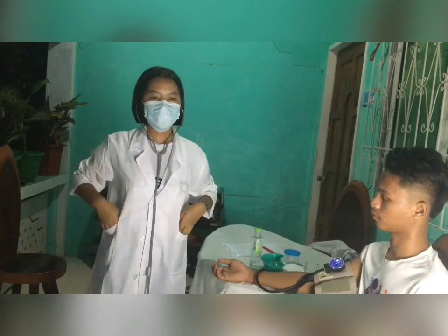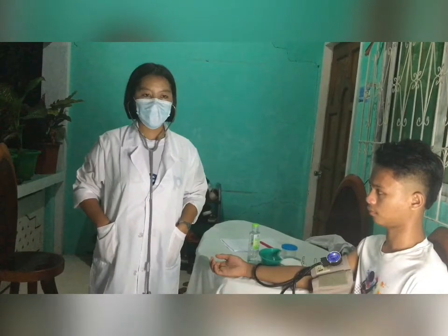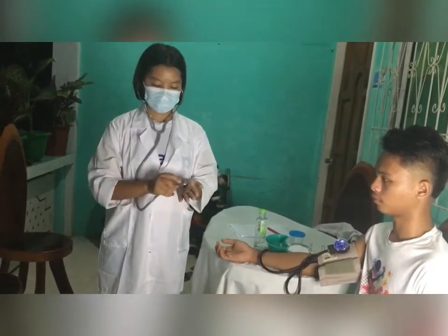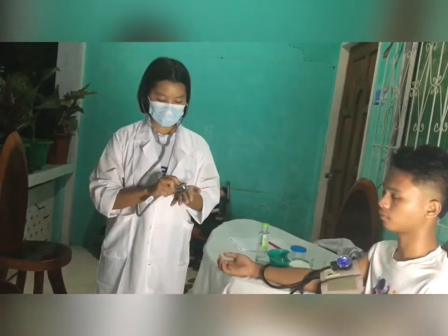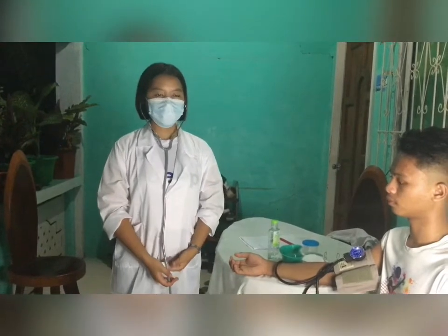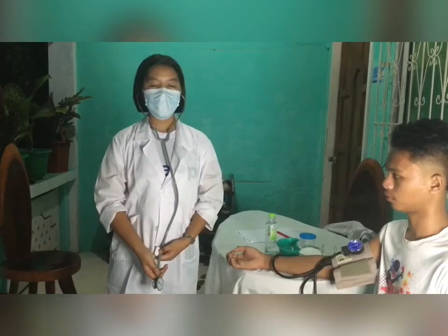Ensure that the stethoscope hangs freely and is not in contact with any object. Warm the diaphragm of the stethoscope. Locate the brachial artery and place the diaphragm of the stethoscope over the brachial pulse. Secure the chest piece by placing the palm of your non-dominant hand over it.